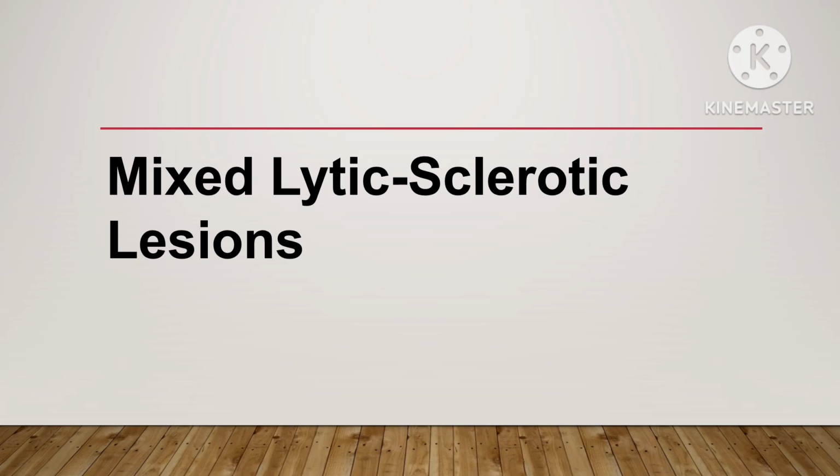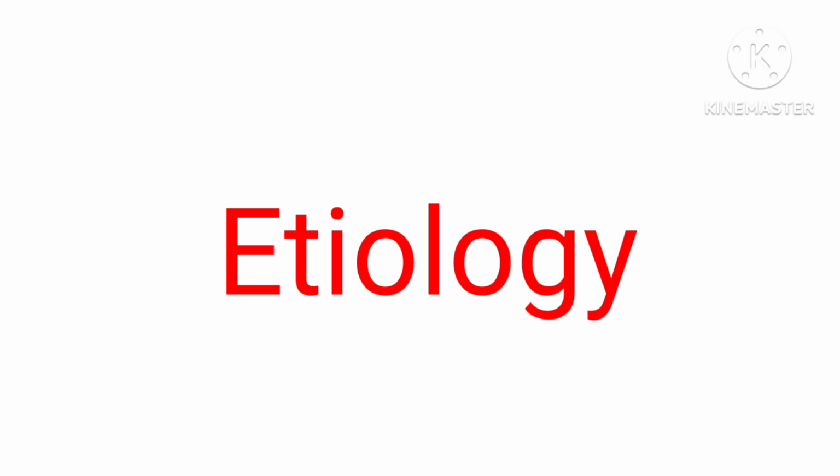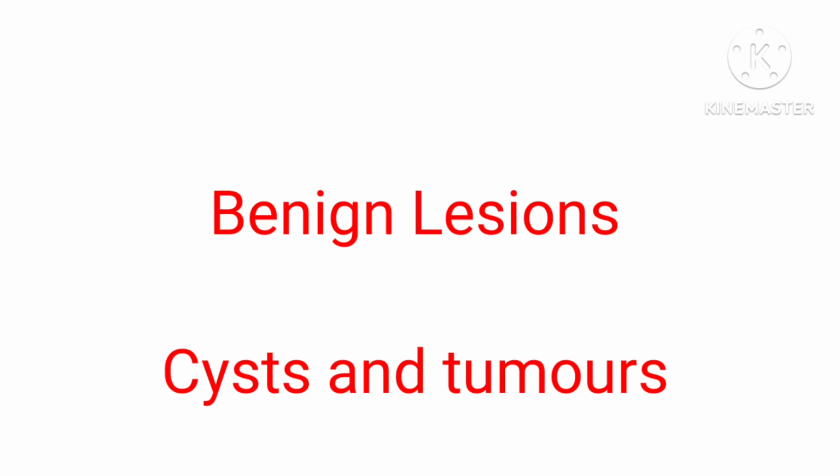Regarding the causes of mixed lytic sclerotic lesions, these lesions can develop in different conditions. This may include benign tumors or cysts, lesions like odontogenic cysts or odontomas may show a mixed lytic sclerotic pattern. Inflammatory conditions, chronic inflammation can lead to bone resorption and new bone formation, which creates the mixed appearance. Even neoplastic processes, especially benign tumors like cementoblastoma, can cause this mixed pattern due to bone destruction and the reparative process.